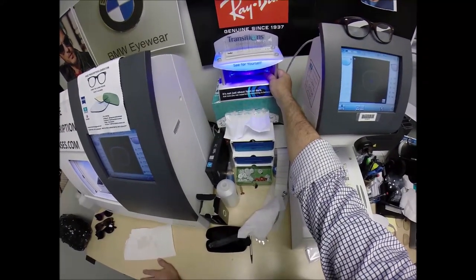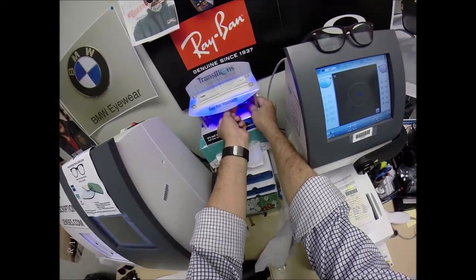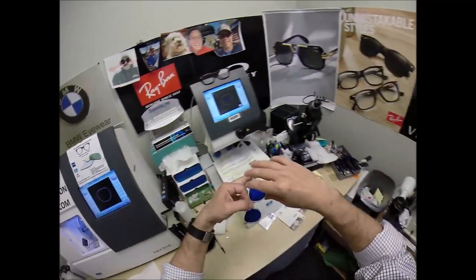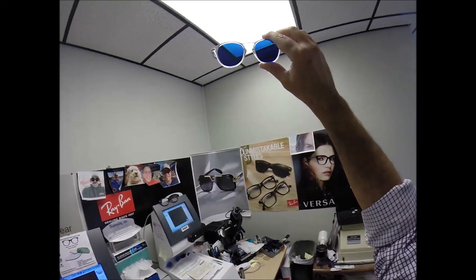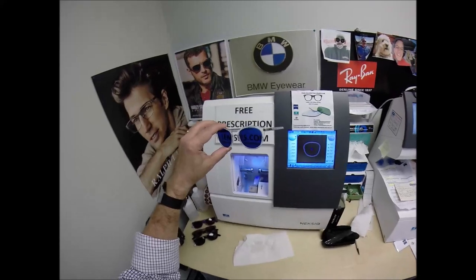Now, Robert and everyone else listening, this is important. All photochromic transition lenses will turn dark on day one and continue to darken every day for the first couple weeks they're exposed to the sun. After that, they will work for years at maximum performance.